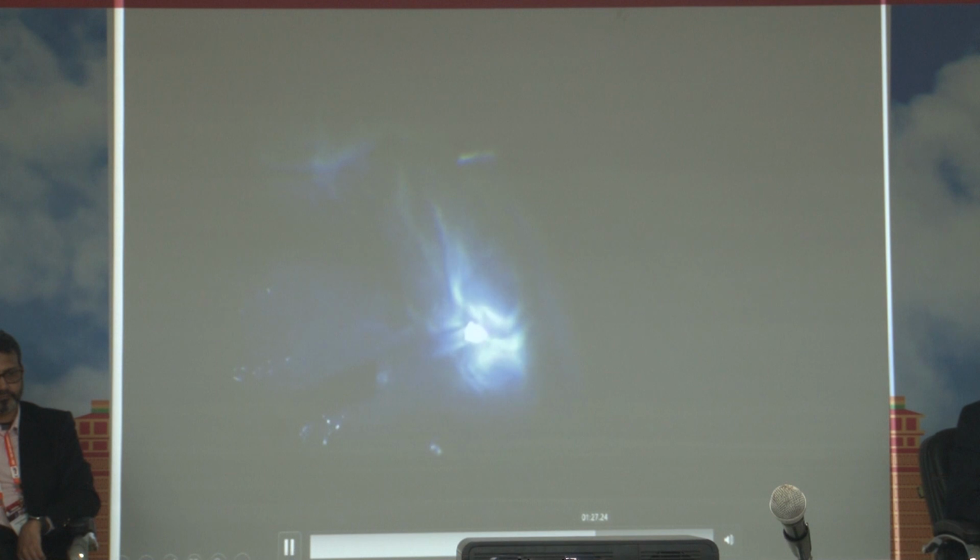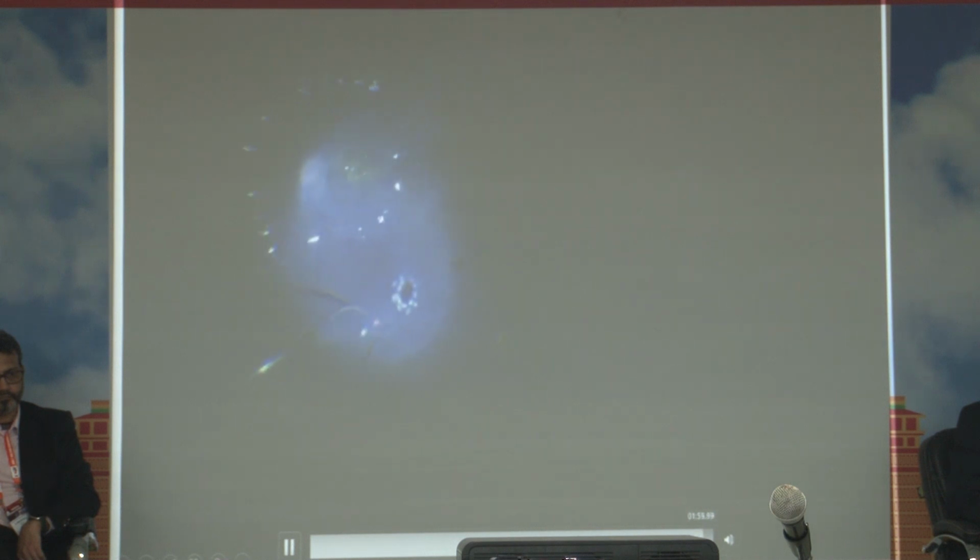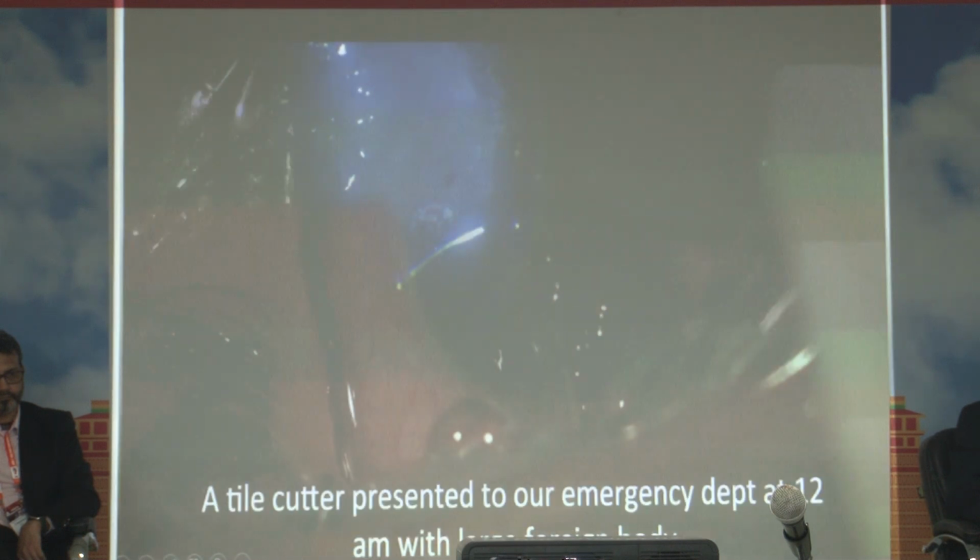And now you can see after the removal of most of these membranes, and here luckily we could remove most of these membranes without doing much retinectomy in this case. So the peripheral barrier laser was done, and the breaks were lasered, and finally the retina was attached well.